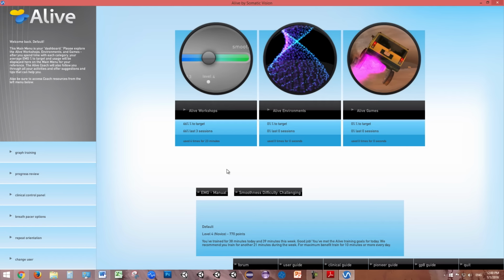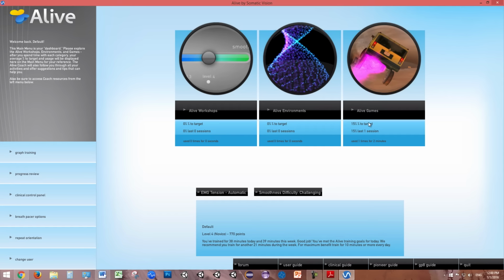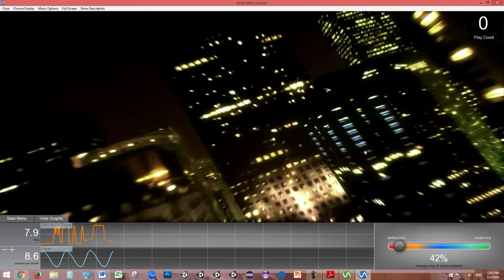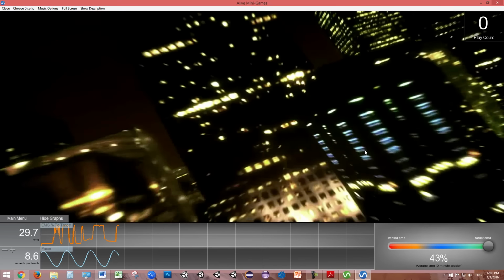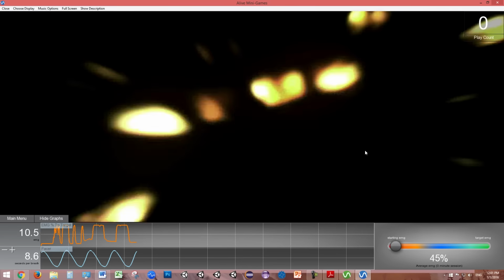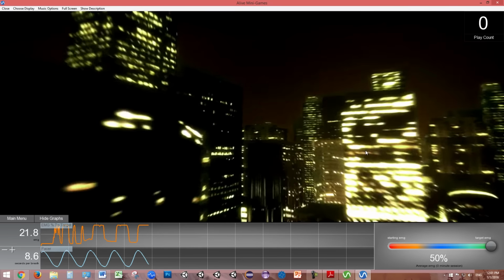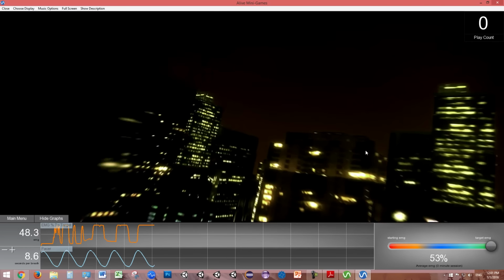From the Alive main menu feedback dropdown, select EMG Tension Automatic. Then, from Alive Games, choose Night Flight. When I tense my muscles, we fly forwards, and if I relax or decrease tension, we fly backwards. Without straining your muscles, try to maintain tension to continue a forwards flight.